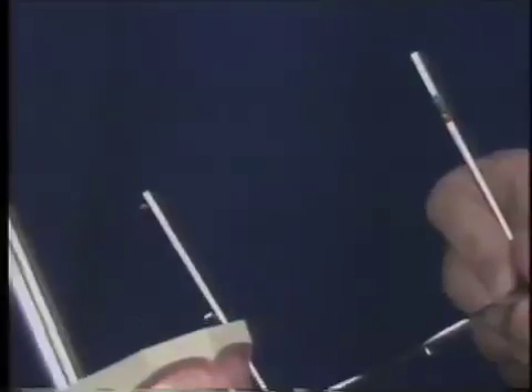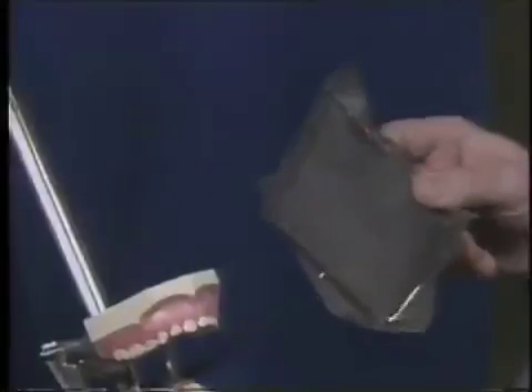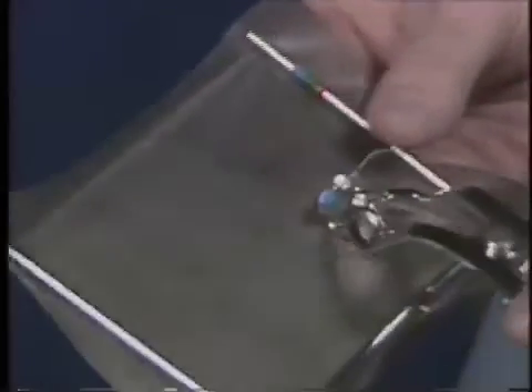To put the rubber dam on as one unit, the punched rubber dam is put on the frame by attaching it to the four corners. The rubber dam should be tight enough to be securely on the frame but loose enough that there is a lot of flexibility. Now put the clamp on the rubber dam by stretching the rubber dam over the wings of the clamp. Use your index finger to make sure that the cheek, buccal mucosa, and lip are not caught in the clamp. Using the clamp forcep, put the clamp firmly on the most posterior tooth, seat it securely, and carefully release the retaining ring on the forcep. Carefully release the forcep and remove it slowly. If the clamp begins to unseat or to rotate on the tooth, you can easily stop the dislodgement or rotation with a forcep. The clamp should be stable without any rocking on the clamp tooth.